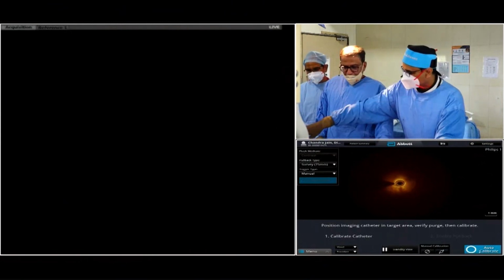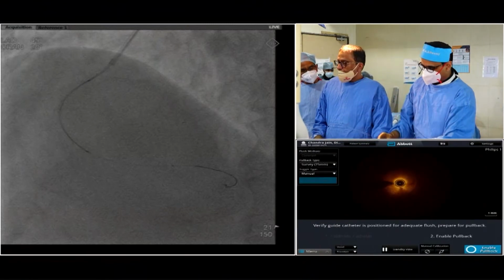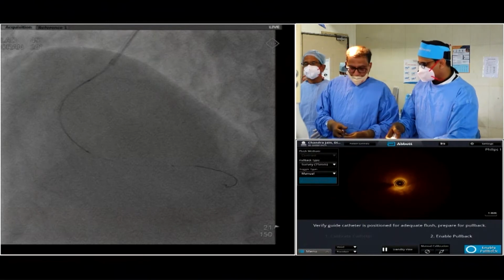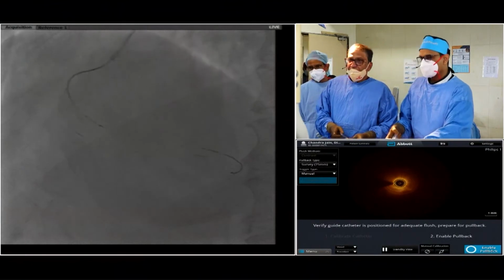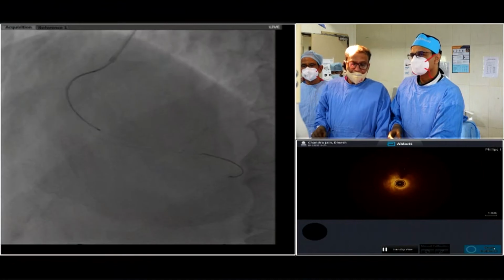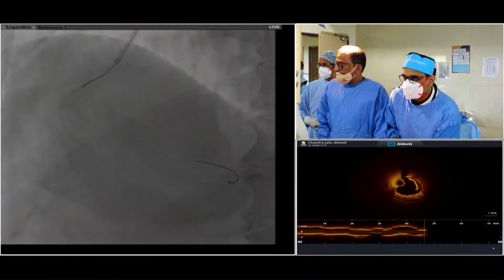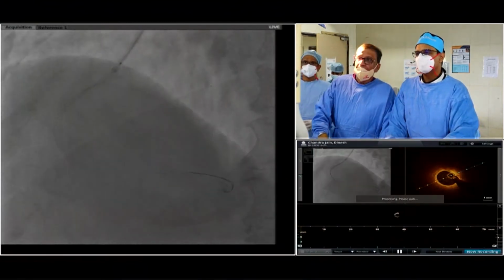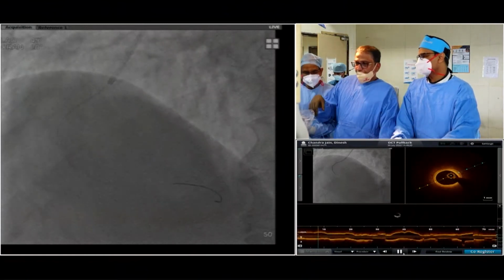Clearance, please. Fantastic. Okay. I have not injected any contrast. I just check on the live image whether I've got clearance from the OCT, just 2 ml injection. You're doing the saline injection again? Yes, 20 ml, 50 ml syringe. Are you ready? Okay. Stop. This time the image. So this is normal saline I've just injected. No alcohol. Can you show the OCT?